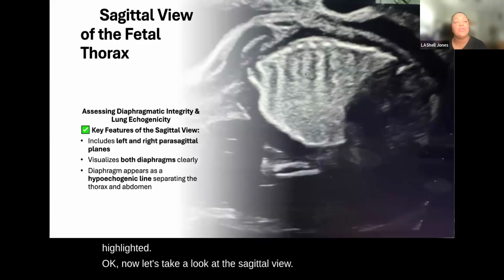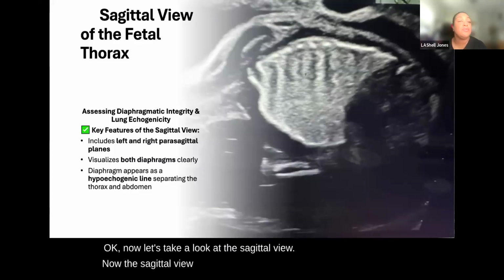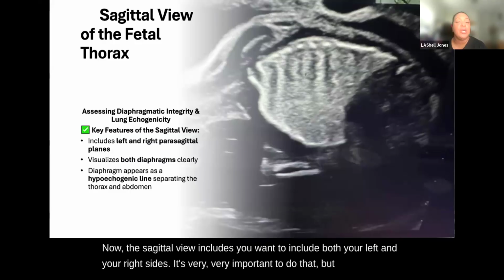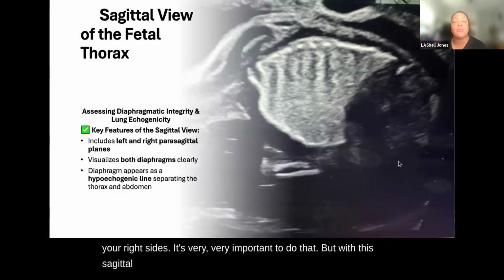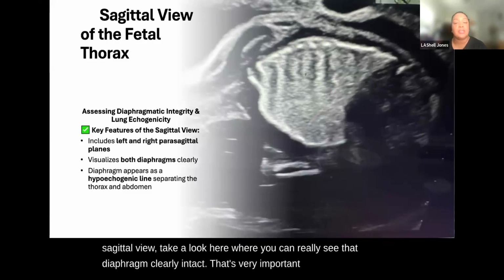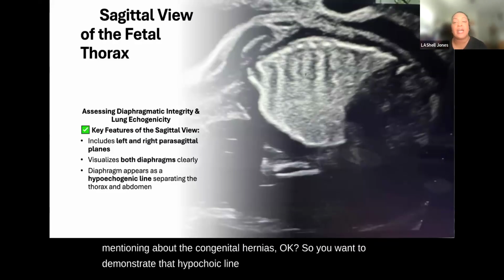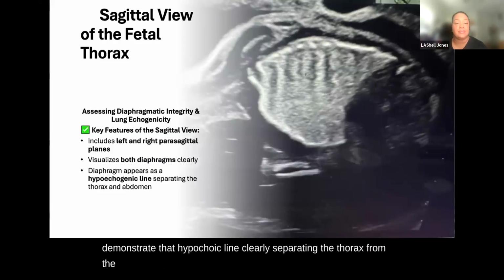Now the sagittal view, you want to include both your left and your right sides. It's very, very important to do that. But with this sagittal view, take a look here where you can really see that diaphragm clearly intact. And that's very important, especially as we were mentioning about the congenital hernias. Okay, so you want to demonstrate that hypoechoic line clearly separating the thorax from the abdomen.